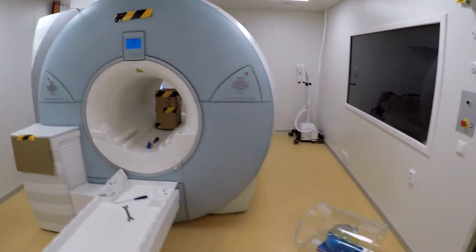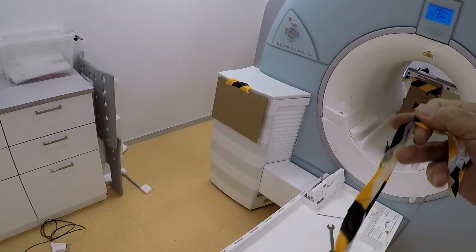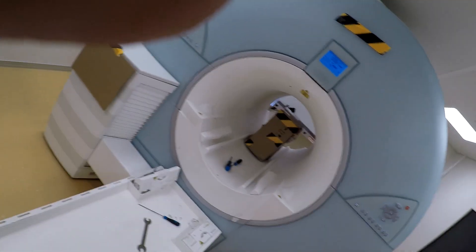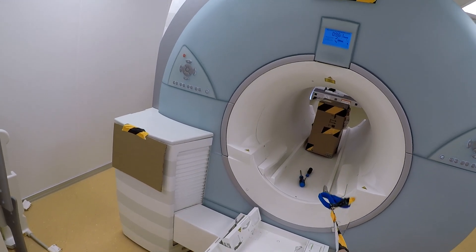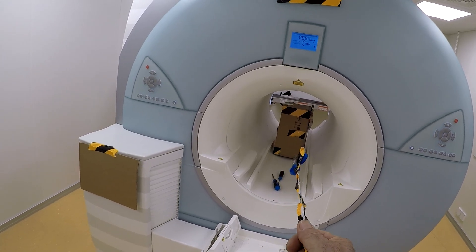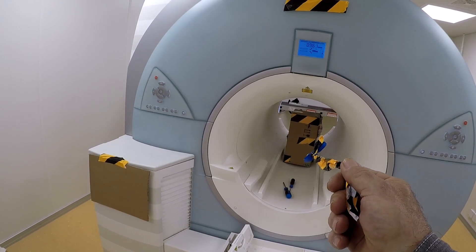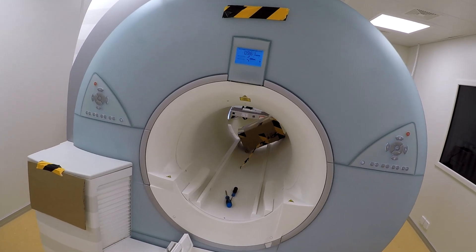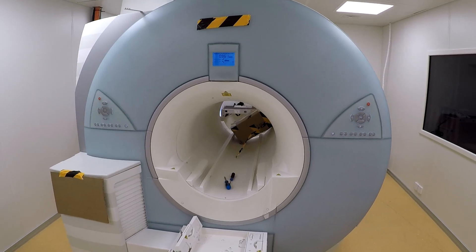Over here I have a normal pair of scissors — a household pair of scissors. You can see the scissors are attracted by the magnetic field, pulling pretty good. All I'm going to do is let go of this piece of tape that's holding the scissors — and there you go. So you can imagine the danger if a patient was inside the bore and a nurse or a doctor walks in with a pair of scissors or something else magnetic in their hand.